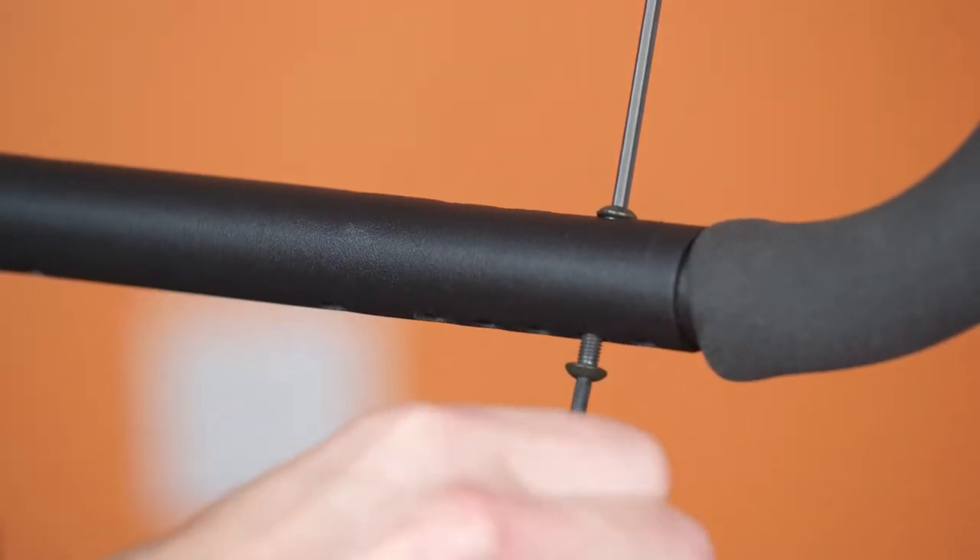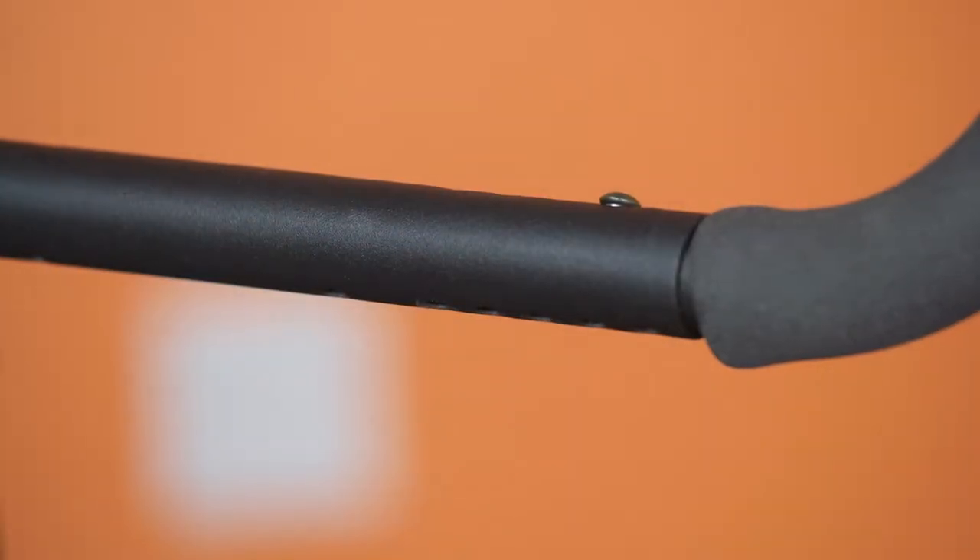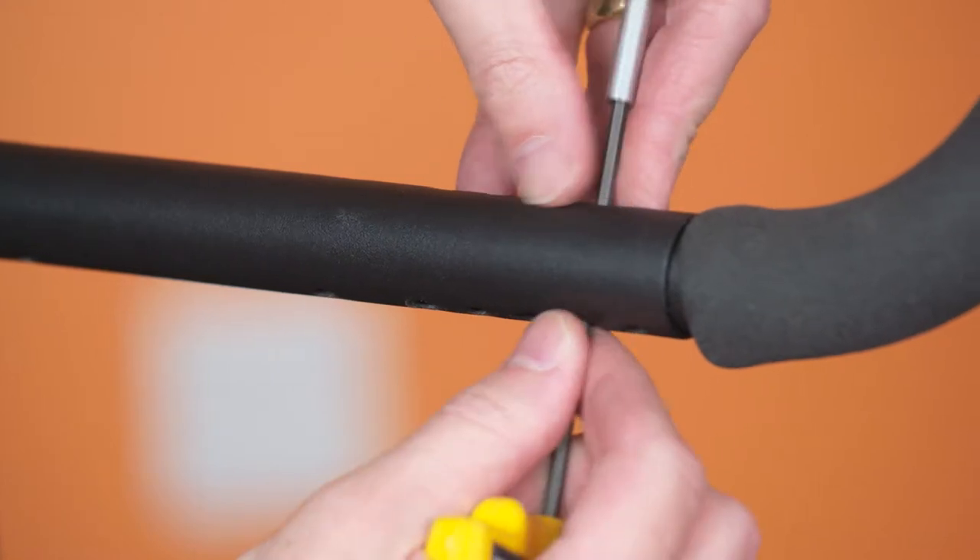Remove the trigger base. Ensure the internally threaded spacer is removed. If necessary, push the remaining spacer and fastener clear of the push bar.